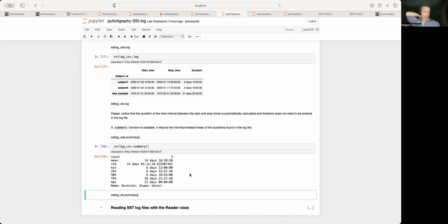It's useful because if you have really large data sets, sometimes a few hundreds of recordings, people inspect visually all of them and report those. But you have to type the date, the timestamp, the start and the stop, and you always make mistakes. That's the truth: you will always make mistakes.